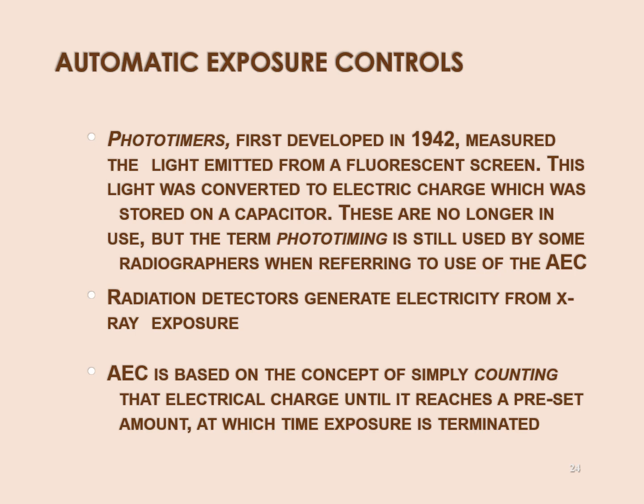It does not time at all. It doesn't keep time. There's no watch components. There's no vibrating quartz crystal or cesium atoms or anything like that. It's not a timekeeping device at all. It's a radiation counter, okay? And since you understand it's a radiation counter, one ionization turns into one electron, and then we start stacking electrons, and then that becomes current, because then we can push those electrons down a wire and it becomes current. If you understand that, then you understand how an AEC works, and you can understand how you can screw up using an AEC, which is basically the second half of this lecture.